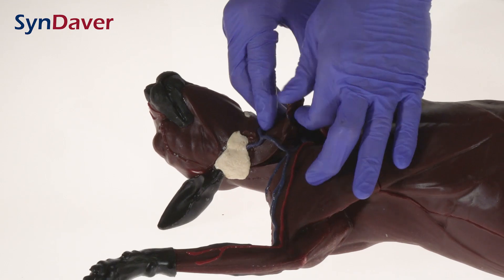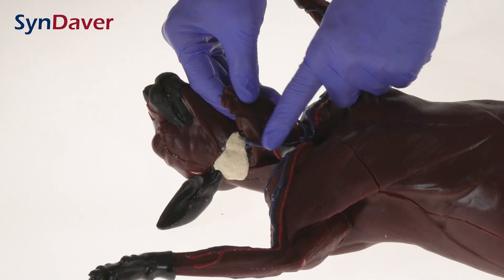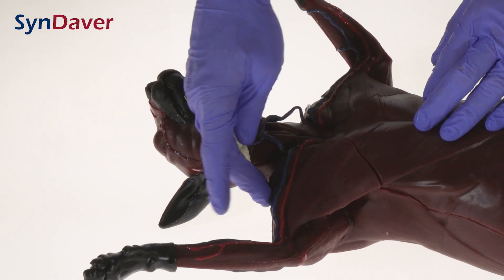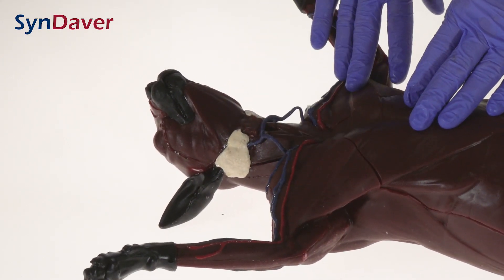We also have a liftable section so you can actually see the trachea and the vasculature, the cephalic, and the muscles along the arm — specifically the biceps, triceps, and the pectoralis muscles are represented.